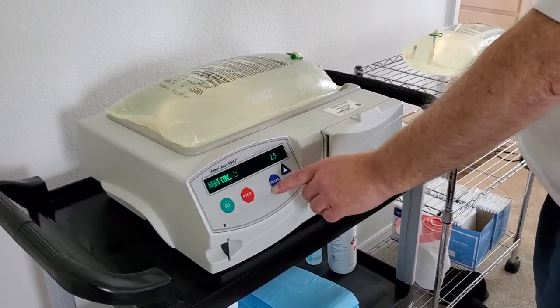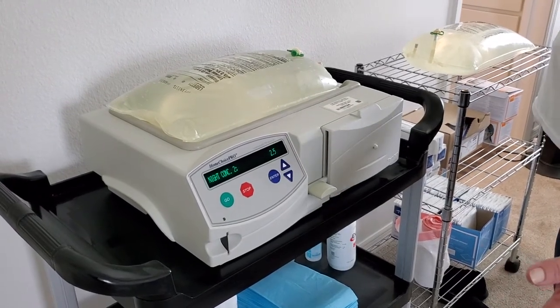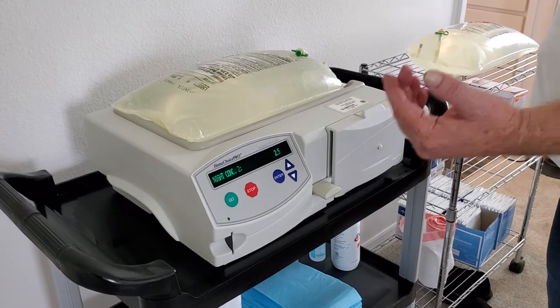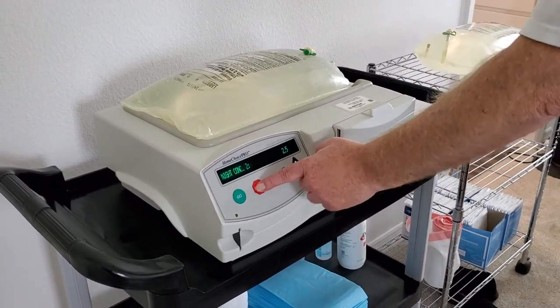I hit enter. I've programmed all my vitals and what I'm using for my solution. Now I can just hit stop.